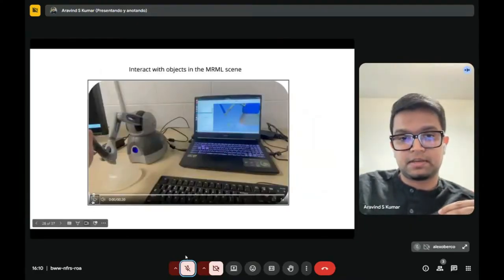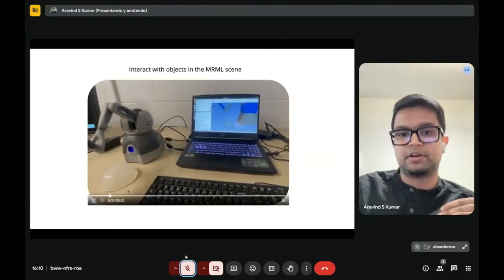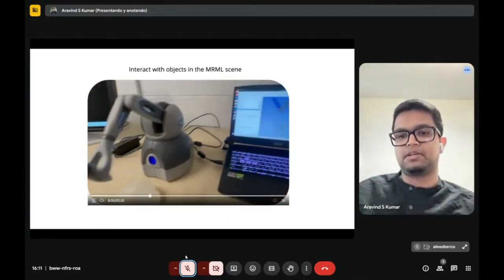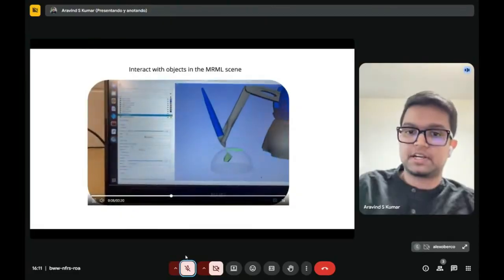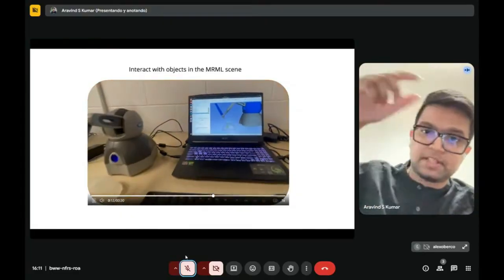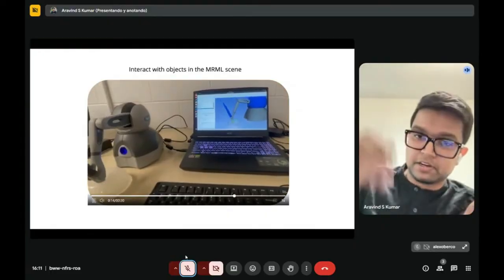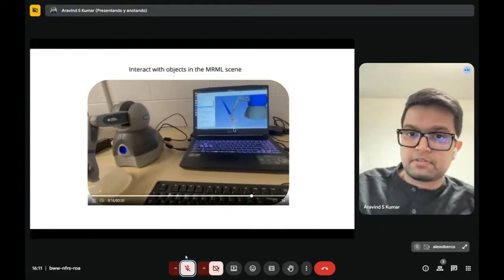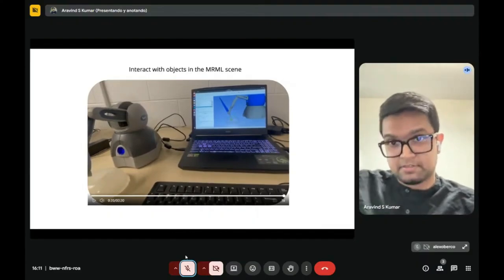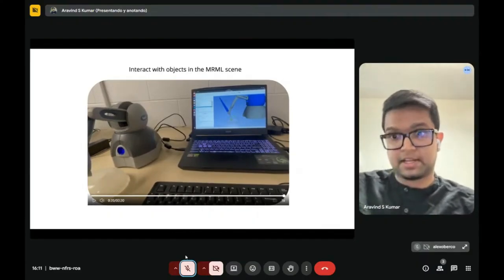And this is the same thing in action. We're going to use that white blob to assume that that's the region where the surgeon shouldn't get too close. And when the knife or the cutting tool gets too close, you see that it will turn red. That means it's in the forbidden region and the surgeon is receiving haptic feedback that it's bad.